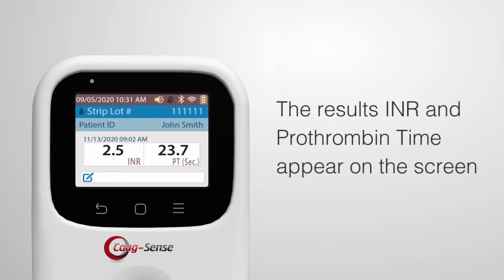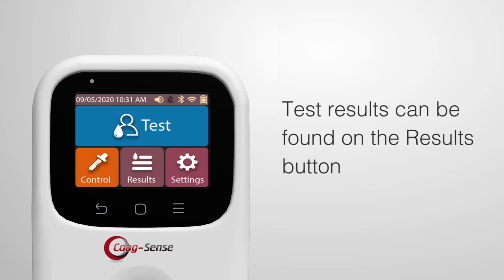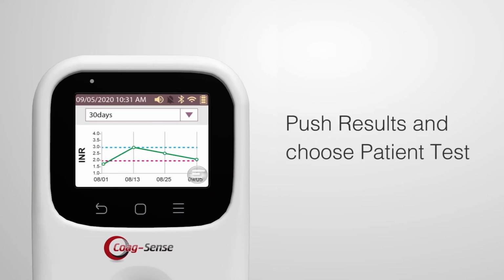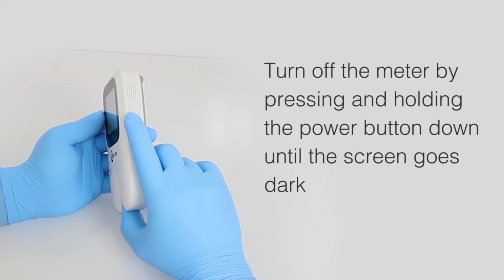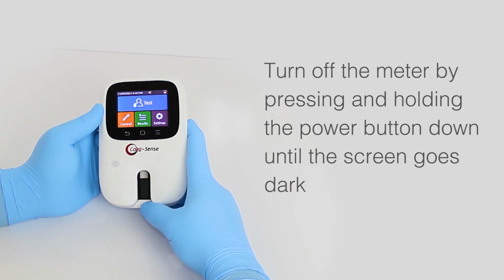When testing is complete, the results appear on the screen. The test result is recorded in memory, and it can be found on the main menu using Results and the Patient Test. Turn off the meter by pressing and holding the power button down until the screen goes dark.